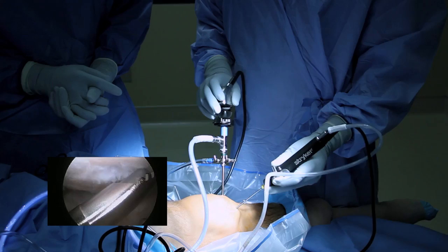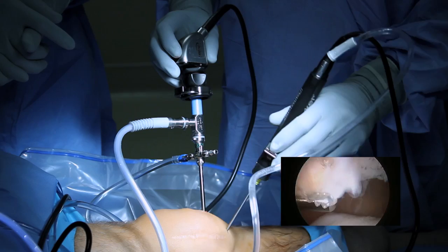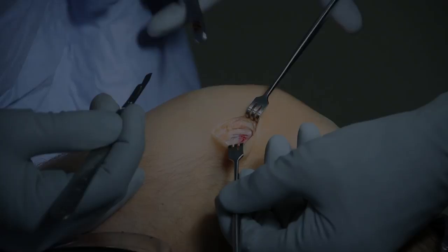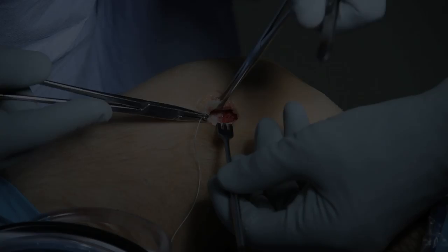In this particular case, the patient had suffered significant cartilage damage to the back of the kneecap as a result of repetitive dislocations. Next, I isolate the medial patella femoral ligament — in this case, at its femoral origin. I could tell from the MRI scan that this was the site of injury for this particular patient.